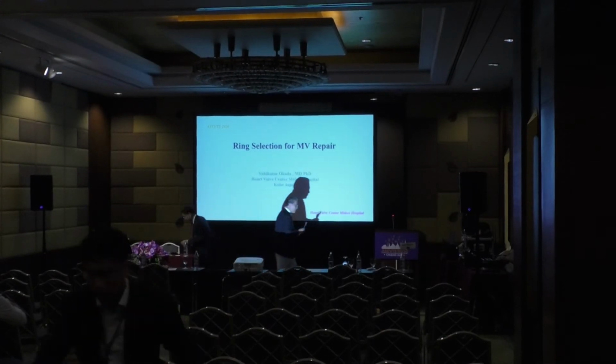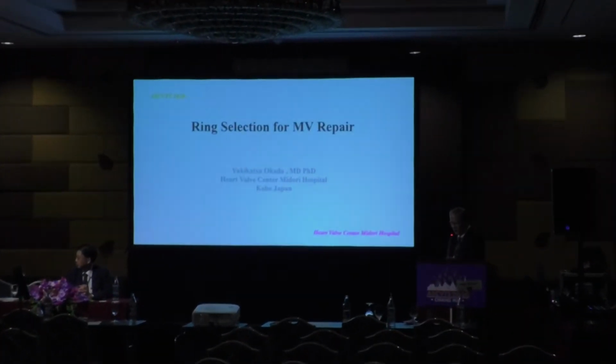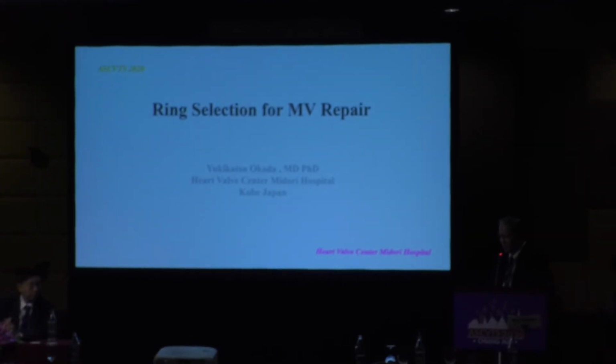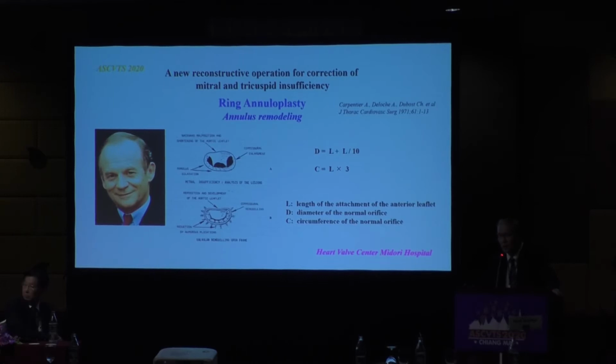I'm a presenter. So Teresa asked me to present my experience of ring selection for mitral valve repair. And as you know, Alain Carpentier developed a new concept of mitral valve repair using a prosthetic ring, so-called ring annuloplasty, meaning annulus remodeling.